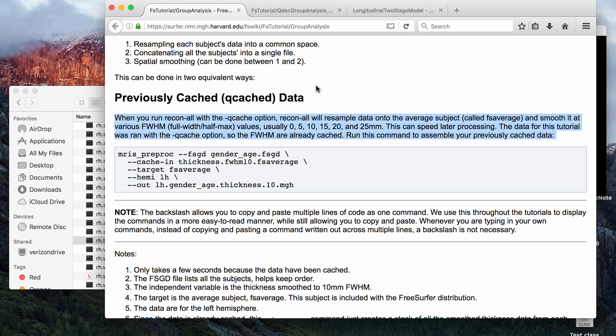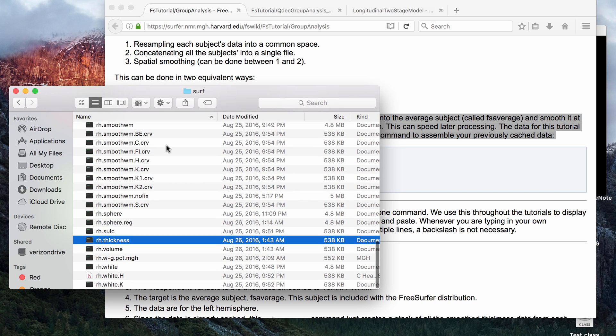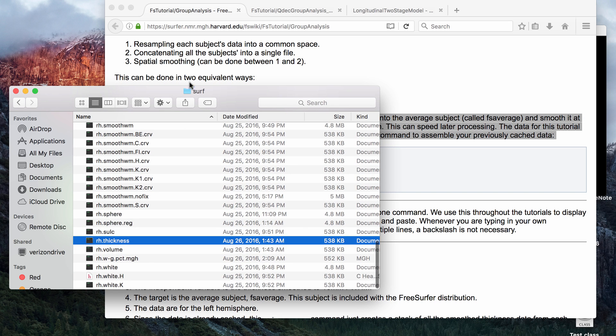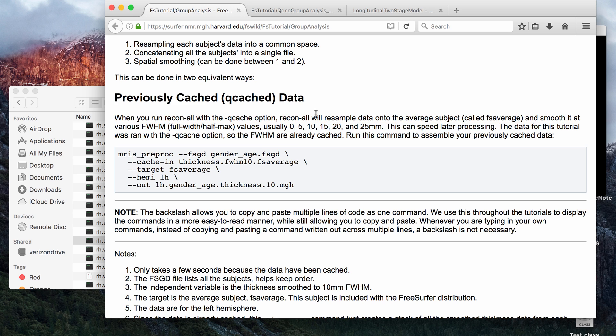This is just going to introduce the concept of the Qcache command or the Qcache tag. The Qcache command, basically what it does is for surface data files from your subject's surface folder, it will create smooth maps using various full width half maximums.